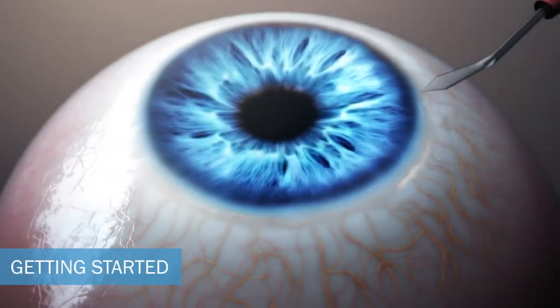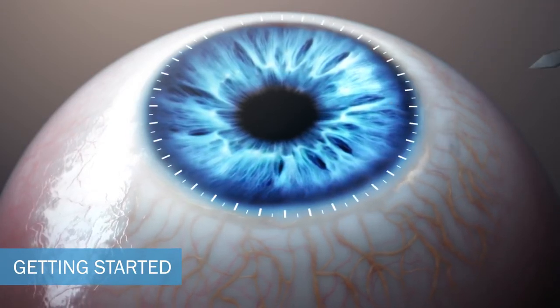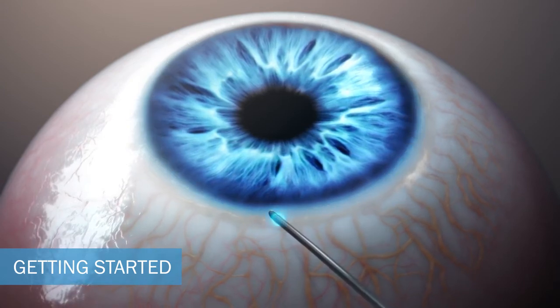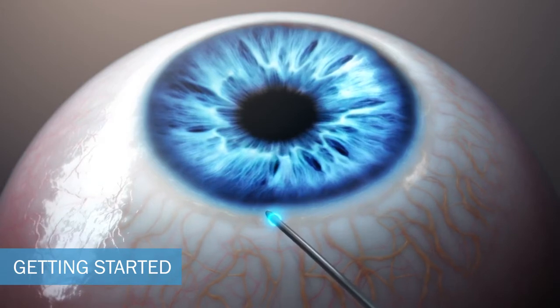The surgeon will sit temporal to the patient to create the keratome incision. A second incision, approximately two clock hours from the intended goniotomy site, is made with a 25 gauge or 27 gauge needle and directed towards the nasal angle.